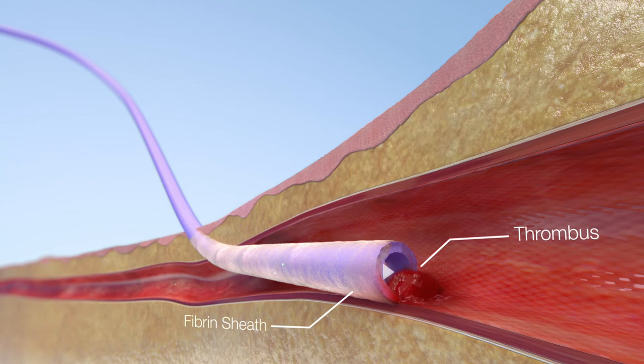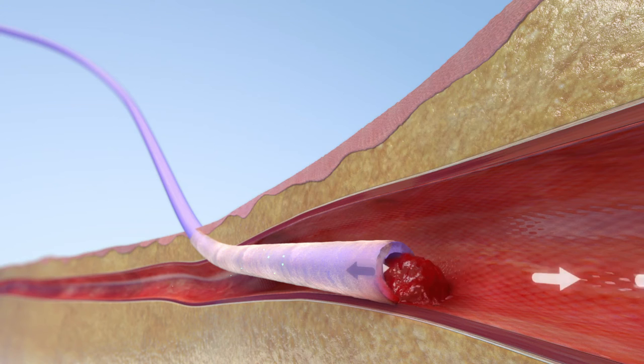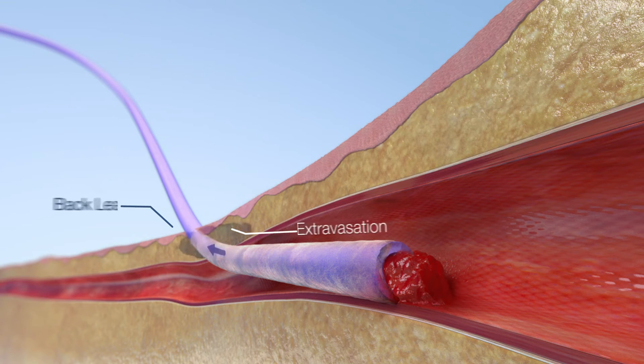In addition to dramatically increasing the risk of bloodstream infection, this can also lead to back pressure and retrograde flow, resulting in infiltration, extravasation, and/or back leaking.